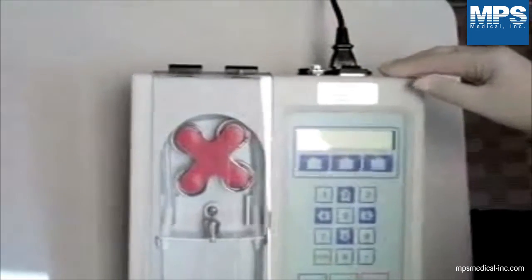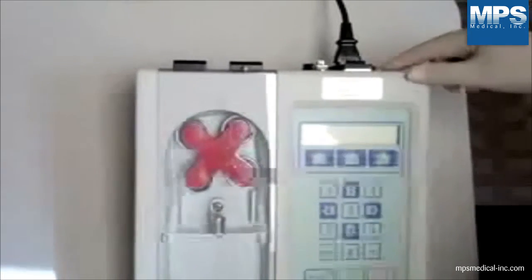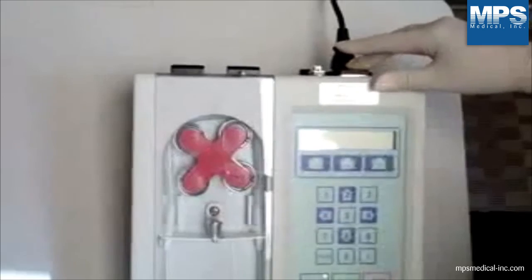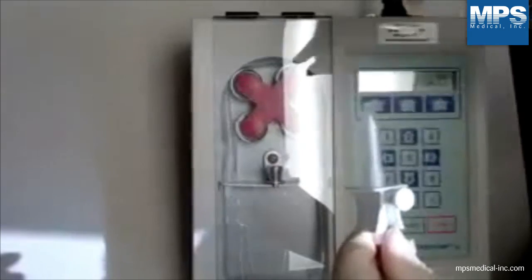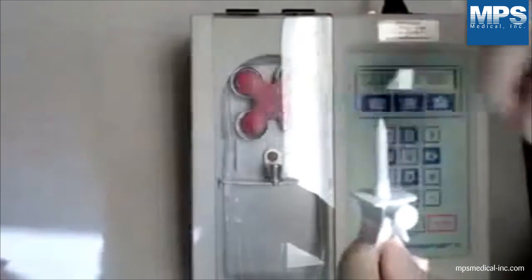Turn the power switch that is located on the rear right-hand side of the pump. Spike the bulk container with the tubing set. Now you're ready to start programming.